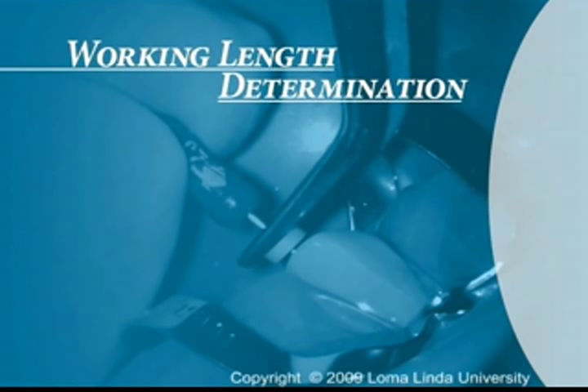Determination of working length is an important phase of root canal treatment. Inaccurate working length can lead to incomplete cleaning, or it can cause over-instrumentation and violation of periapical tissues. In this video, you are going to learn how to determine working length using an apex locator in conjunction with periapical radiographs.